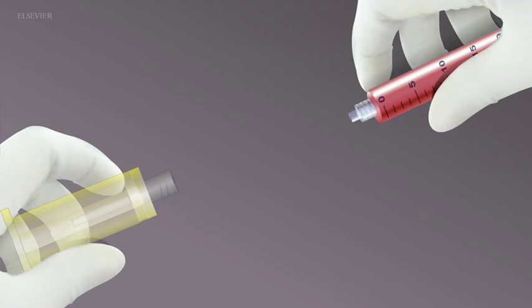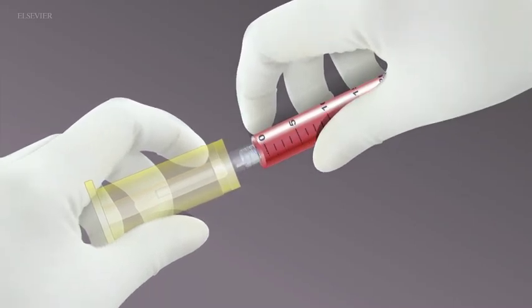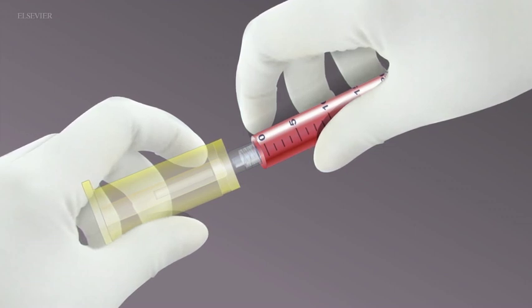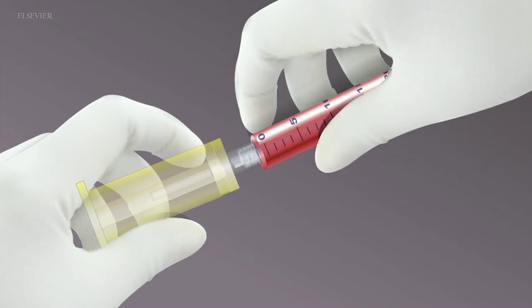Transfer the specimen to the culture bottles. Connect the syringe to a sterile safety transfer device to fill the bottles, ensuring that the syringe nozzle is not contaminated. Do not connect blood culture vacuum bottles directly to the CVAD via the sampling device due to the risk of broth medium reflux back into the vein.